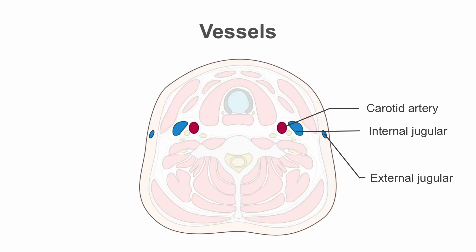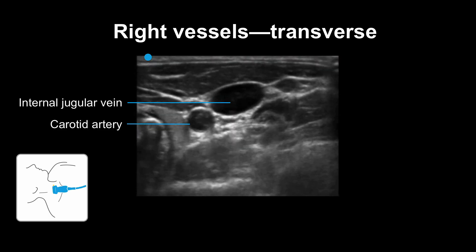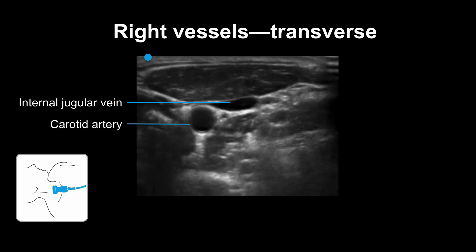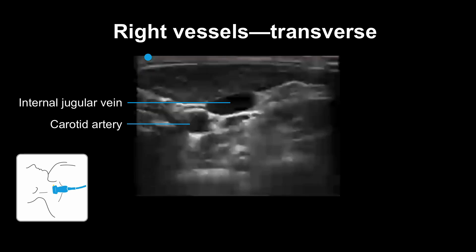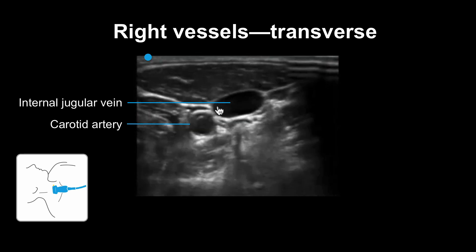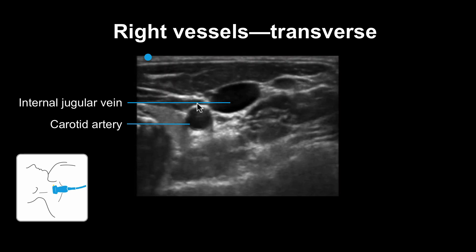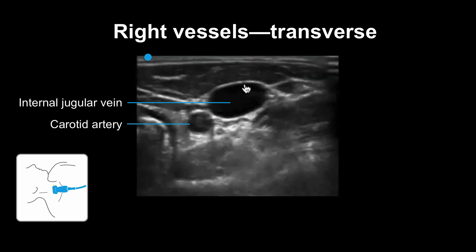Let's take another look at the vessels in transverse or short axis. Here is a view of the carotid artery and the internal jugular vein in transverse view. You can see the internal jugular vein is just lateral and a little bit superior to the carotid artery. Since we're in the transverse view, the vessels look more rounded or oval as the view takes a cross-sectional cut. The artery has thicker walls and is pulsatile, whereas the vein appears relatively more oval, thin-walled, and is compressible.